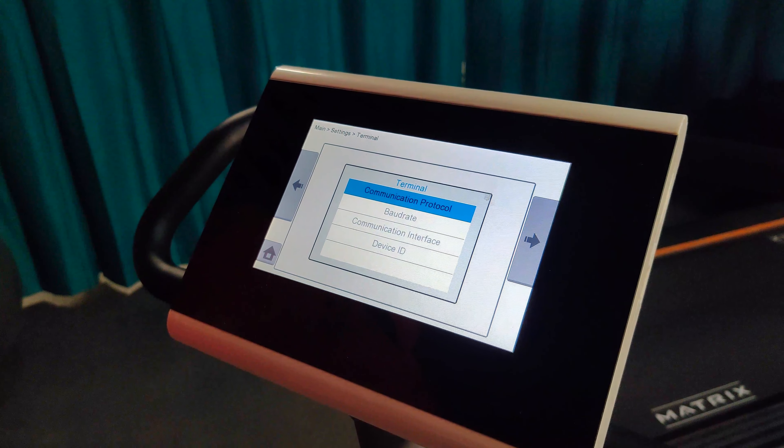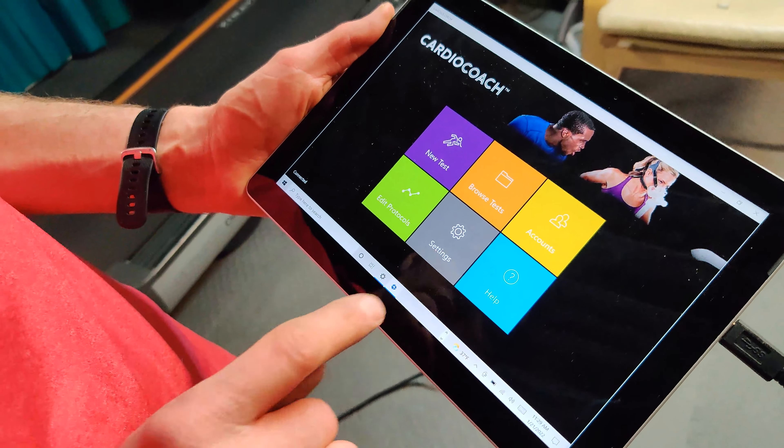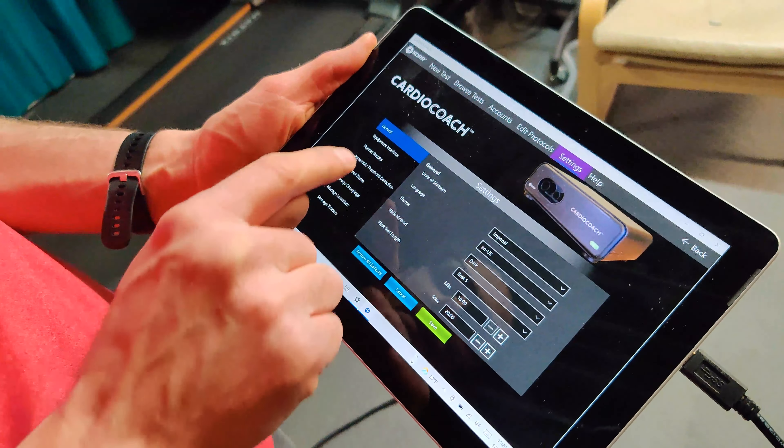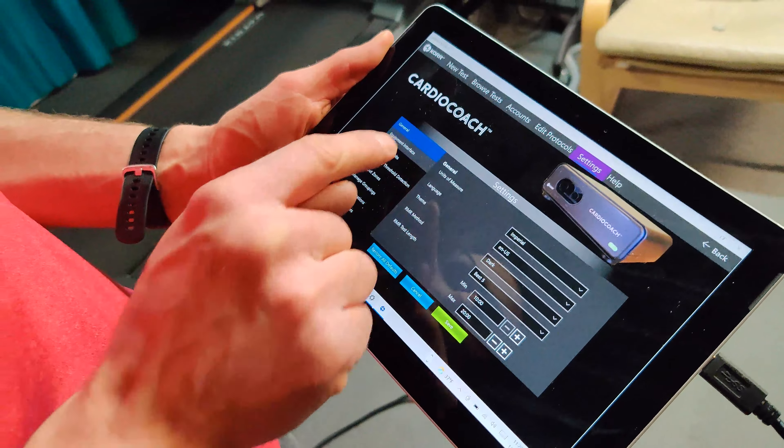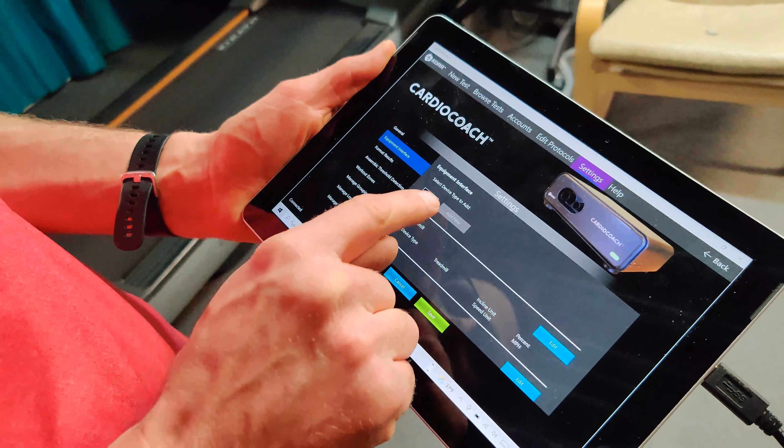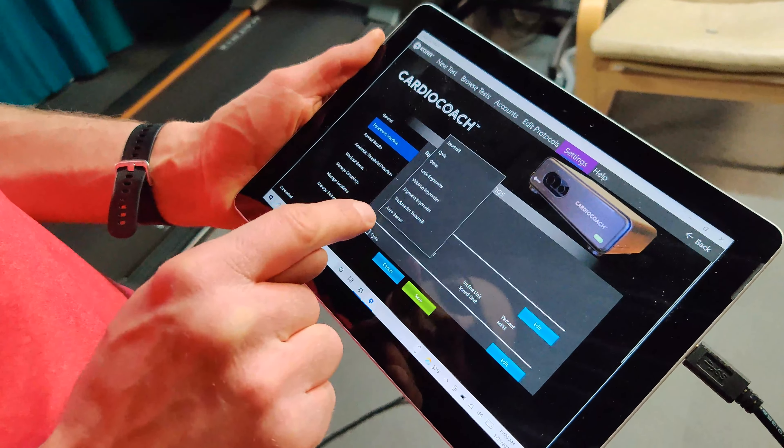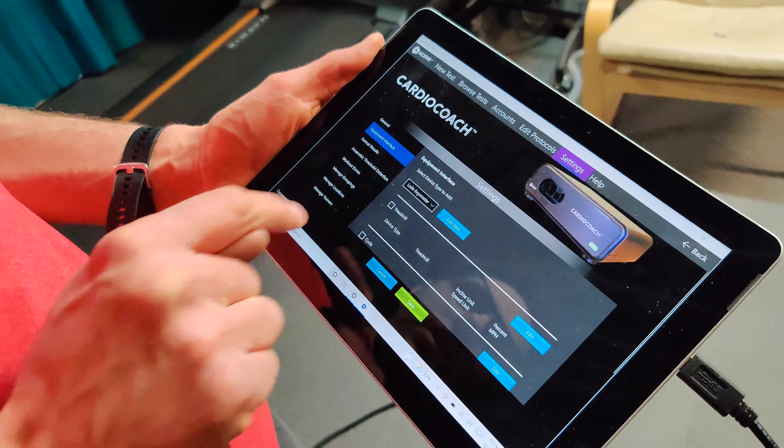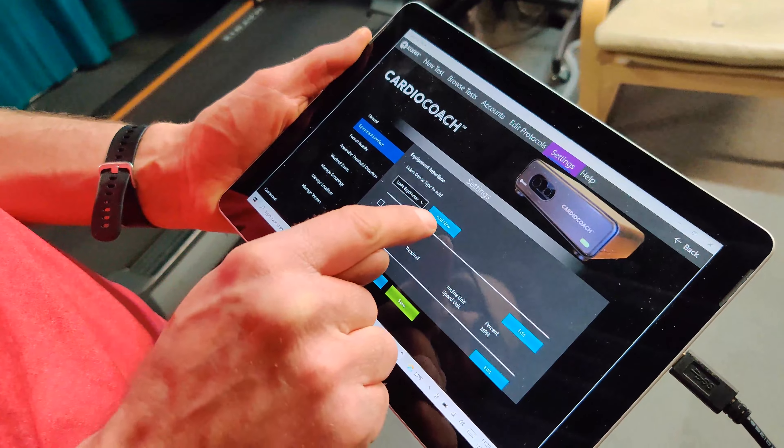Now go to the CardioCoach software, select Settings, then Equipment Interface. In the dropdown under Select Device Type, select Load Ergometer.